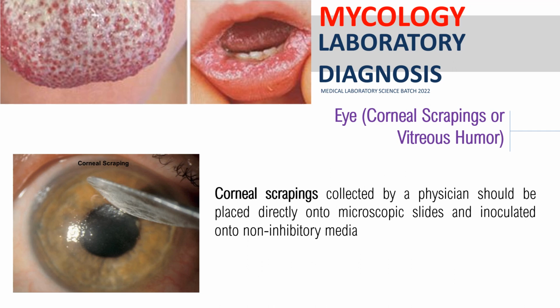the procedure. For the vitreous humor naman, class, ang nagko-collect talaga ay physician. Bakit? Kasi yung syringe, ini-inject dito sa part, tapos kino-collect yung vitreous humor. Ayan. So, very mahirap. And then, yung vitreous humor naman, class, yun yung dinadala na natin sa laboratory.